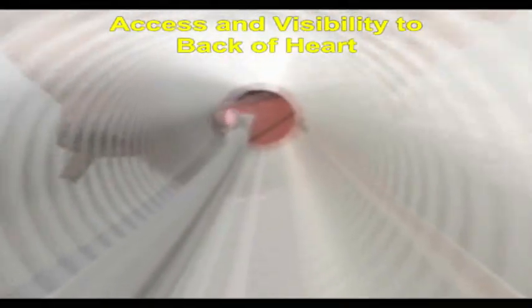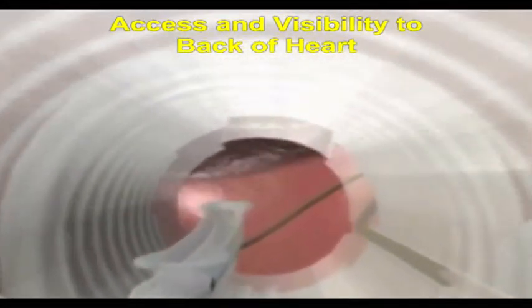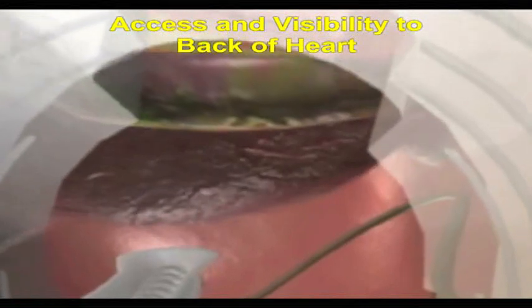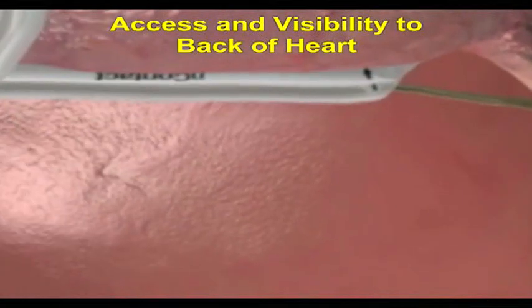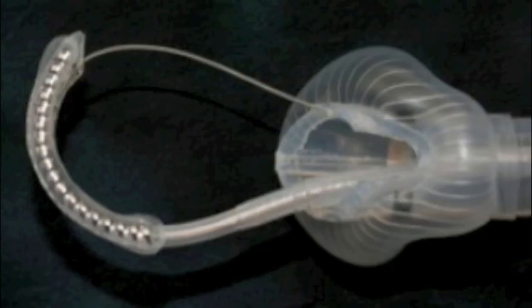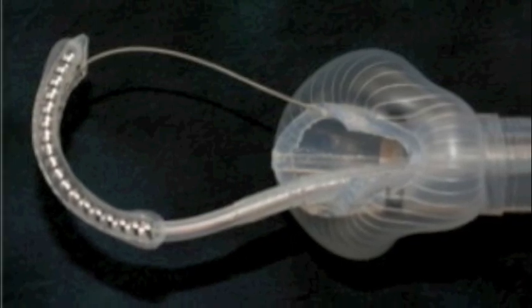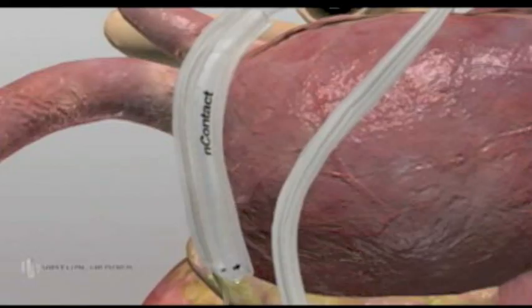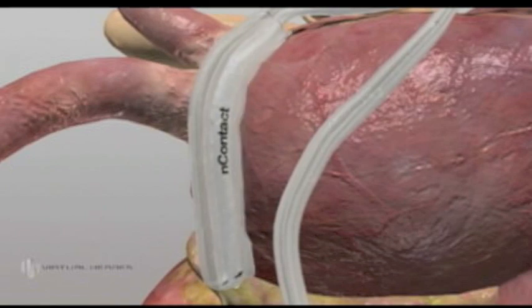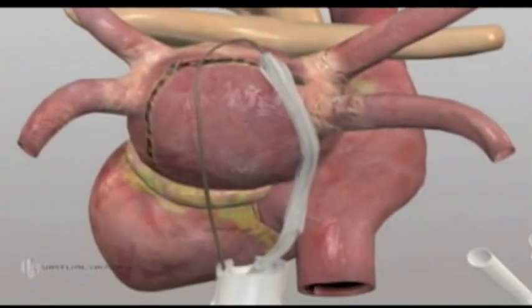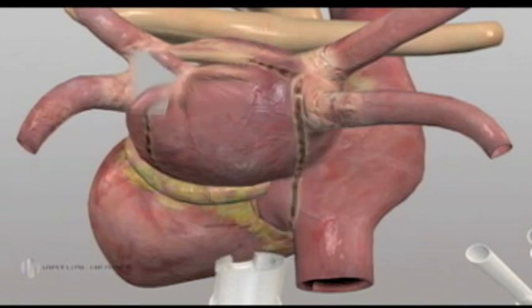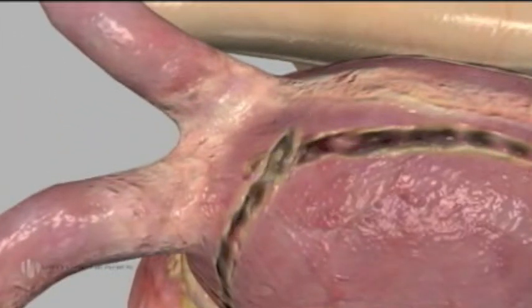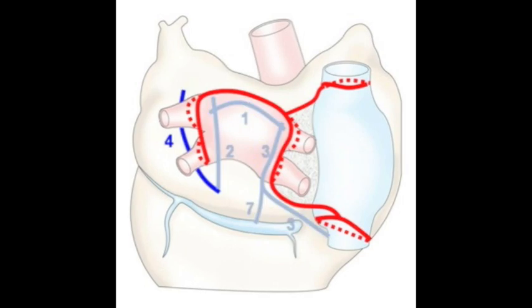The procedure is performed with direct visualization of the beating heart. The specialized electrophysiologic radiofrequency ablation device made by N-Contact is a vacuum device that can be placed by the cardiac surgeon in relevant areas to allow for transmural application and development of scar. The goal is to recreate the classic maze procedure by placing a series of seven burns along pericardial folds.